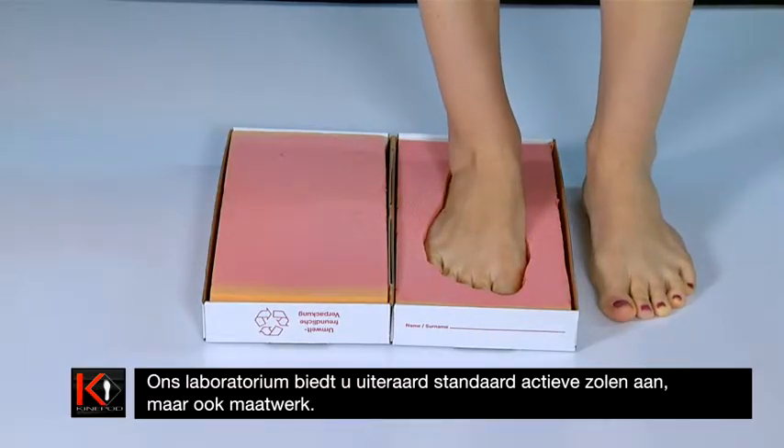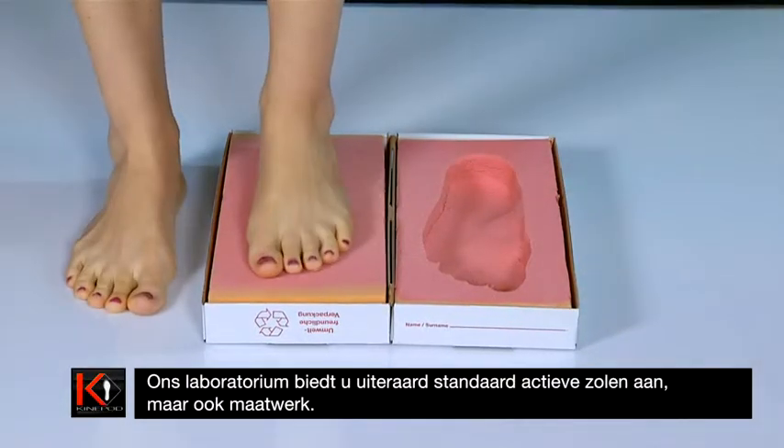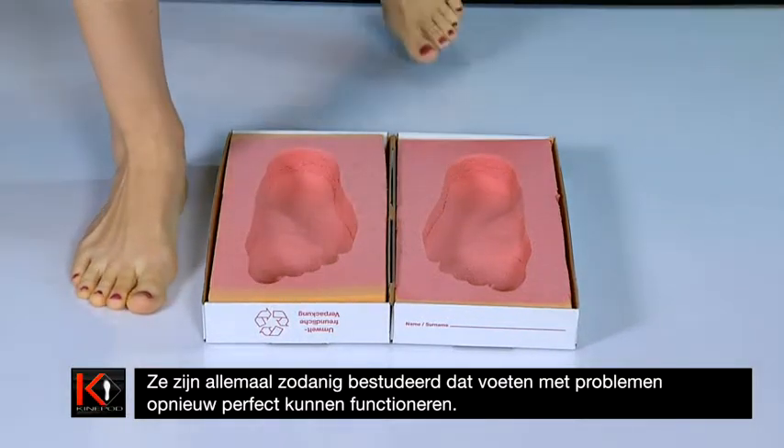Our laboratory offers you standard active soles as well as custom-made soles. They have all been designed to ensure that defective feet can recover perfect functionality.